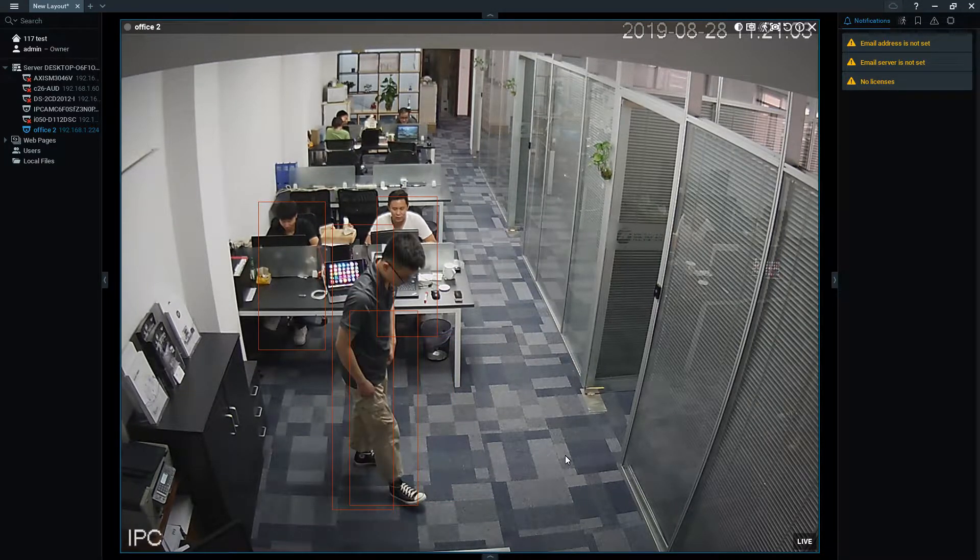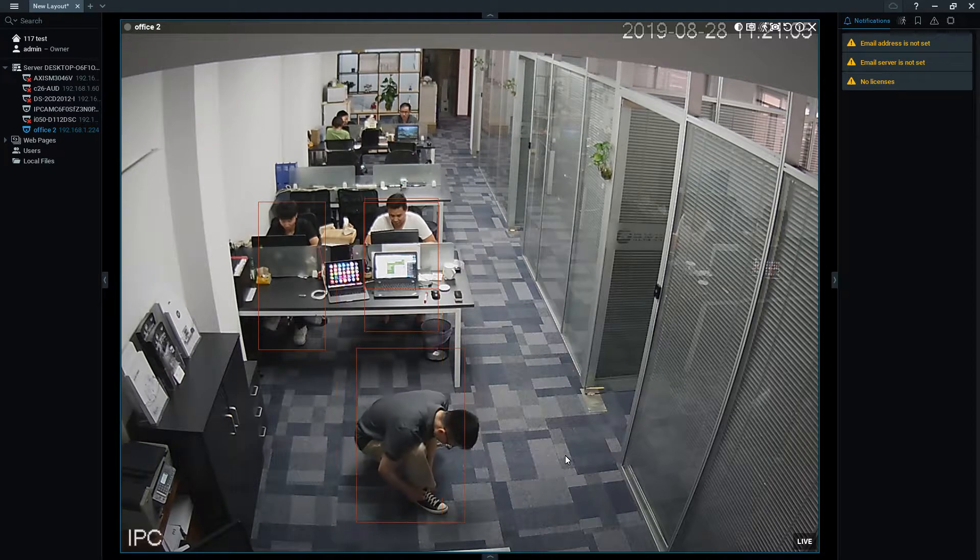What if you tie your shoelace? As you can see, Xiao Qu is tying his shoelace — the alarm also won't go off. The algorithm is very smart to detect that it is not a fall.